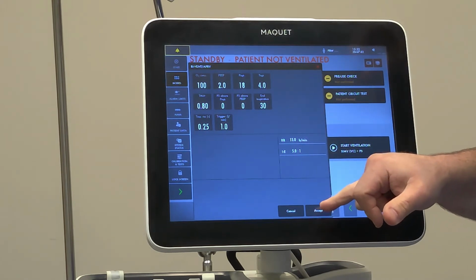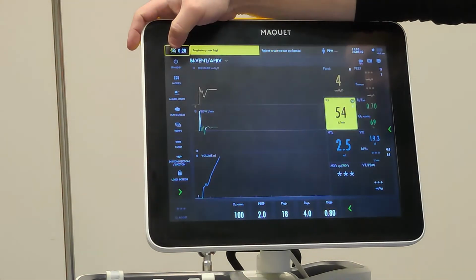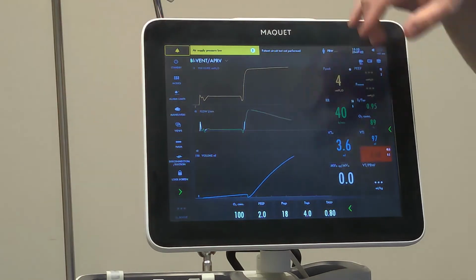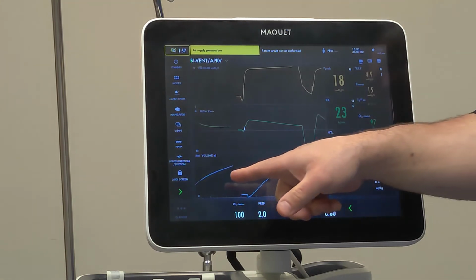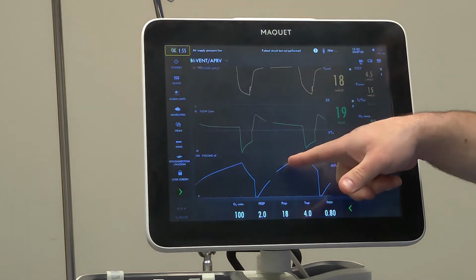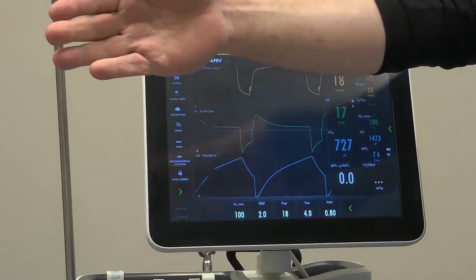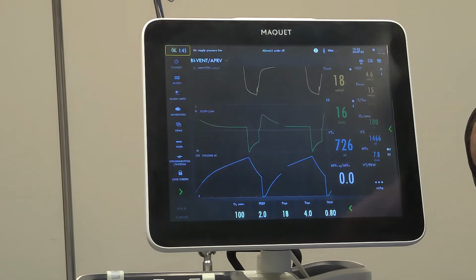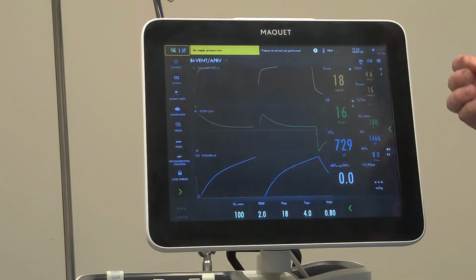So we'll see this in action here. Go back up. So what you'll see here, let me silence that. So what you will see here is long, drawn-out tidal volumes with a short drop. And what this will do is, like I said before, and what will show in the lungs is that it will increase the mean airway pressure in the lungs for a longer amount of time with that short drop to get rid of your CO2.